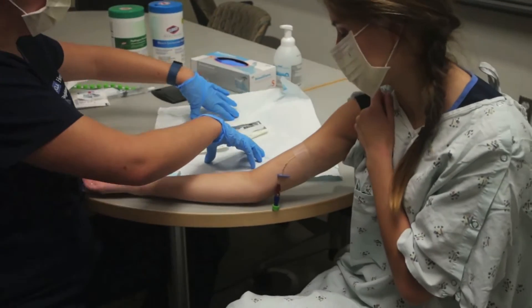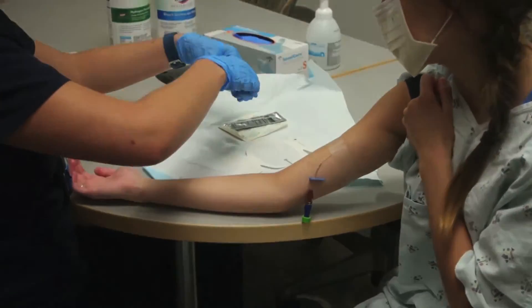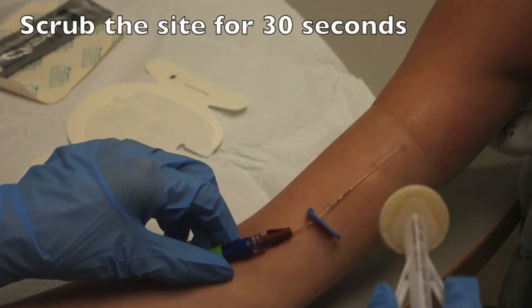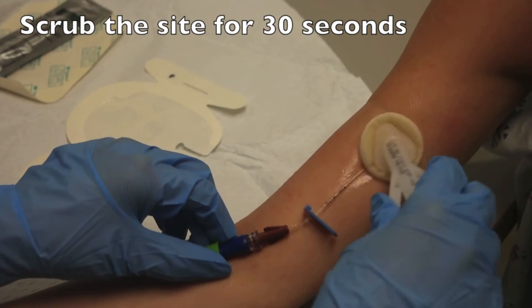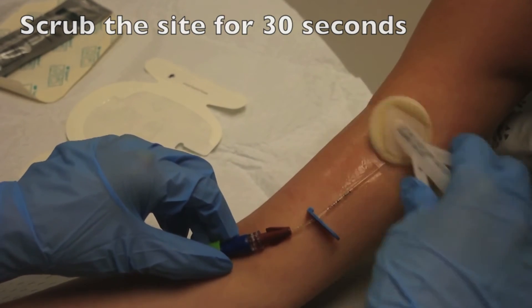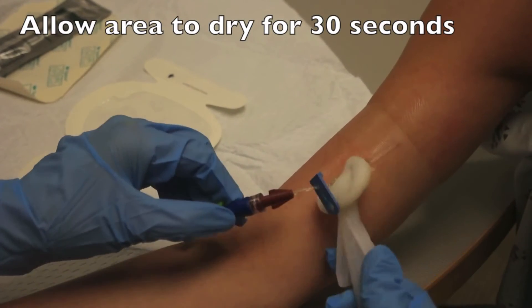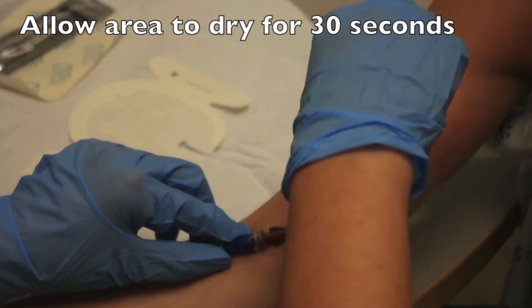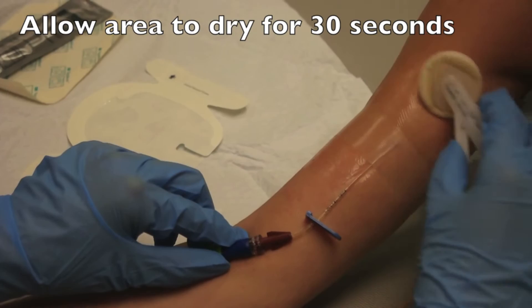Perform hand hygiene again and then don your sterile gloves. Next, pinch the wings on the chlorhexidine applicator to saturate the sponge. Using a back and forth motion, clean the area approximately 2 inches around the catheter exit site for 30 seconds. Allow the area to air dry for 30 seconds. Do not blot, fan, or wipe away any solution.